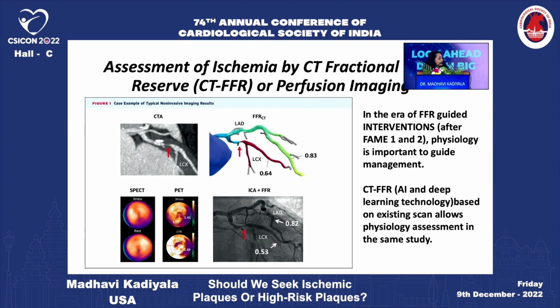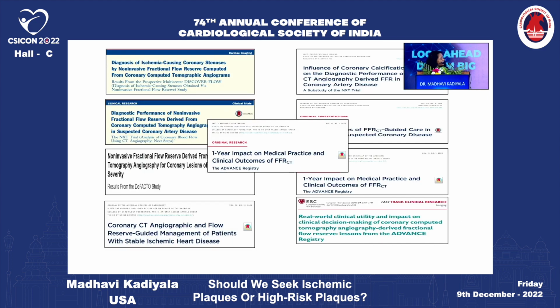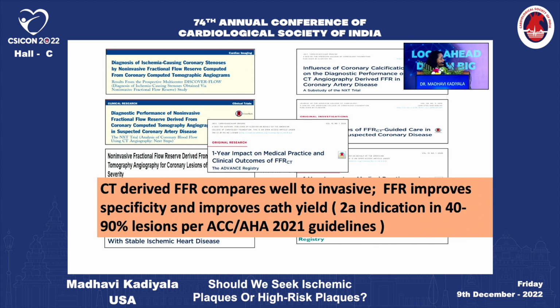And CTFFR is an AI-enabled technology that is available. I understand it's not available here, but it is an add-on technology that doesn't really require any additional scan acquisitions. It's a post-processing software that they can do and give us the numbers. It's been well validated. Multiple studies have been done.